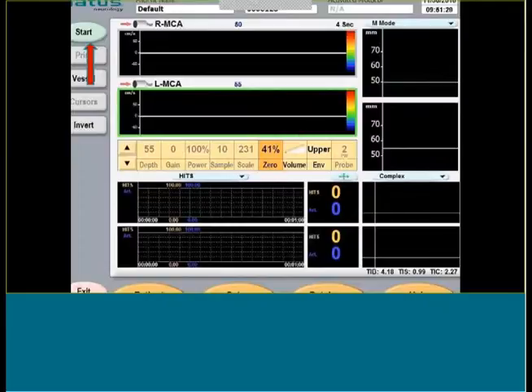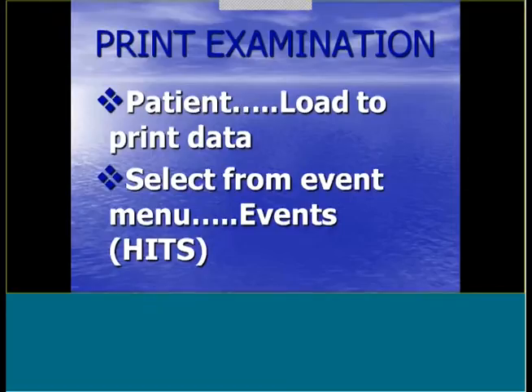Okay, and I don't have a picture of these different complexities. I should have put that in there. But like I say, it's like energy distribution and the speed of the cell. Emboli look like little goldfish in these scenarios, because they're traveling. Artifacts don't travel anywhere, so they look very sinusoidal, so to speak. So it's the speed of the cell, the energy.